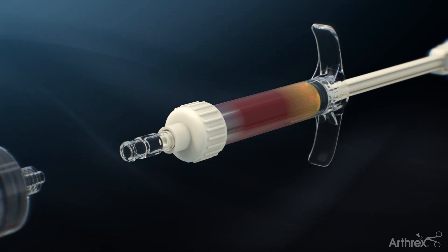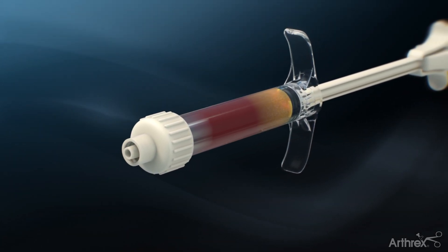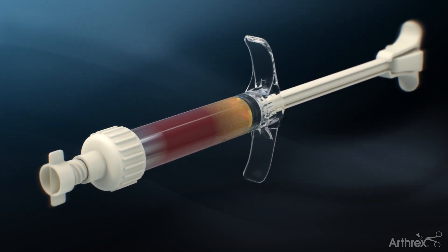The female to female luer adapter is removed and the luer cap is secured to the mixing syringe.